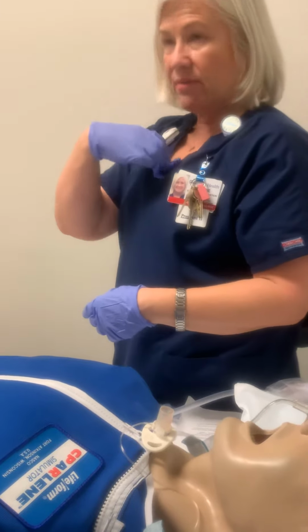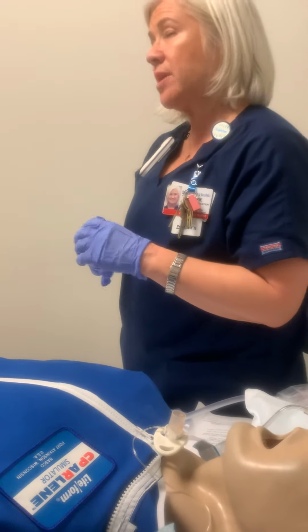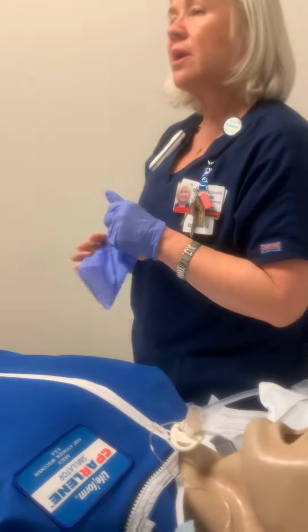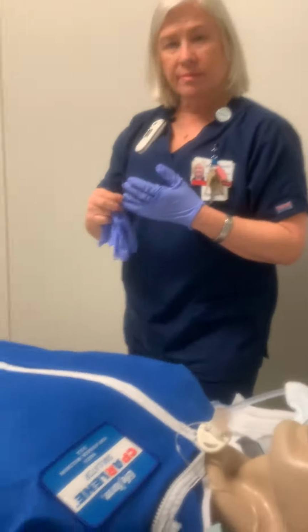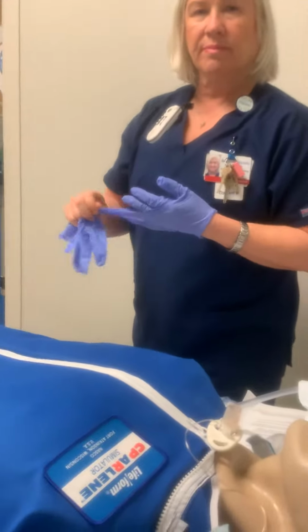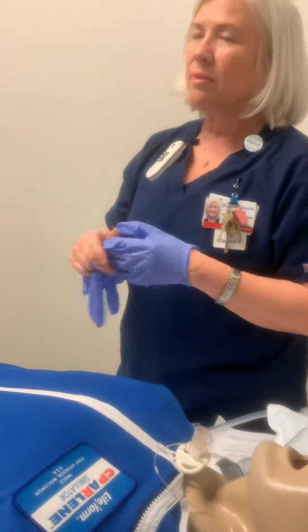Okay. And they can breathe fine, but they still have to have the trach in the event that they need it. Okay. So there are many different types of trachs out there. It just depends what you're going to use it for. And does the cap just prevent the air from coming out, and no worry about debris? No. Okay. And so they probably want them to talk, but they have to leave the trach in because they may need to use it.